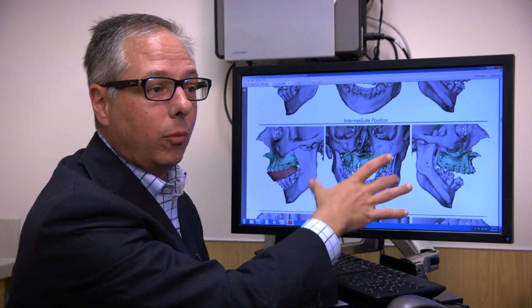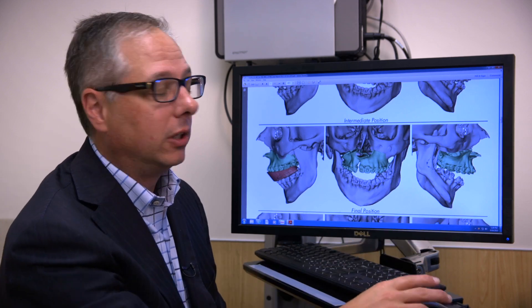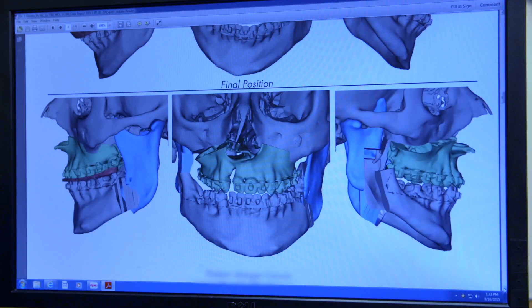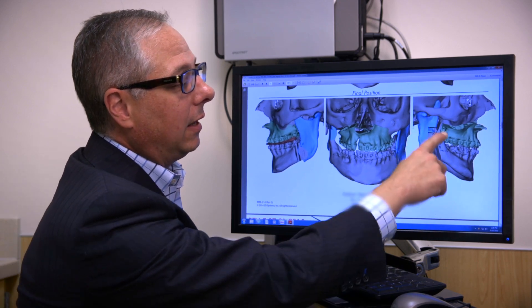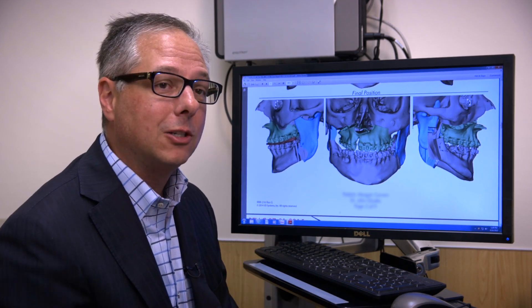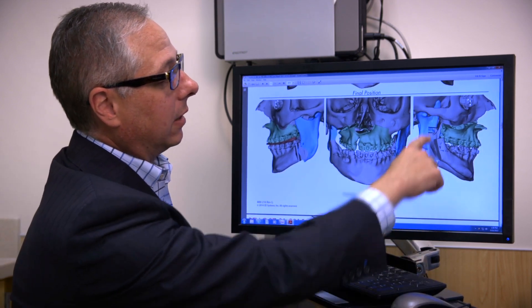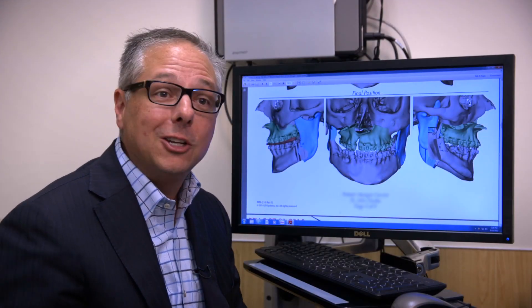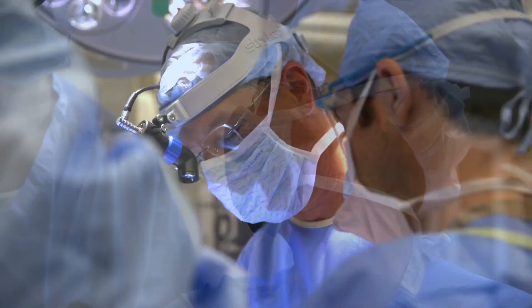The second part in the operating room will be to reposition the lower jaw, or the hemifacial component, and hold it in its new orientation. Technically, we prefer an inverted-L osteotomy on that side compared to a sagittal split on the normal side. We're able to recreate on the computer the area that we will need to bone graft at the end of surgery. The computer helps us determine the size of the bone graft needed and how it will fit together. You can see how we've straightened out the facial profile as well as the occlusion. In conjunction with your orthodontist, virtual planning allows us to be accurate within a millimeter with no guesswork in the operating room.